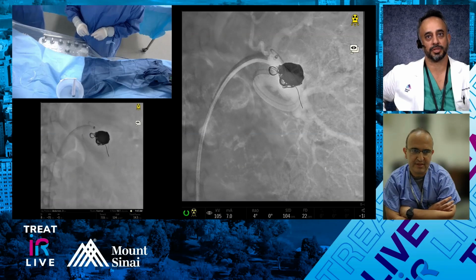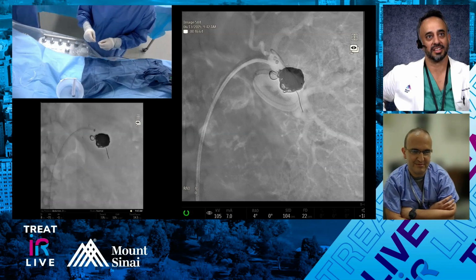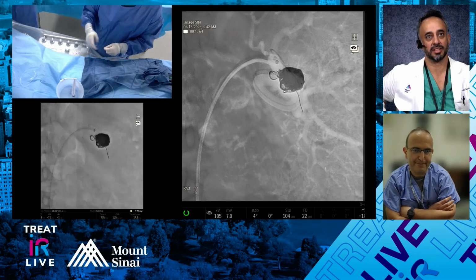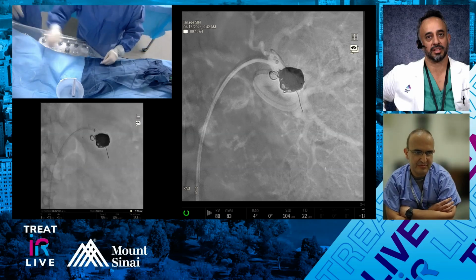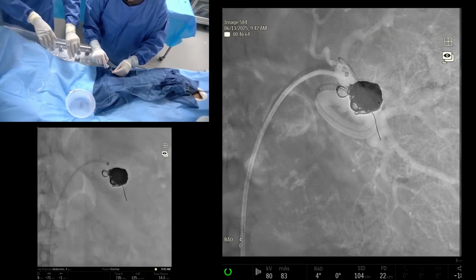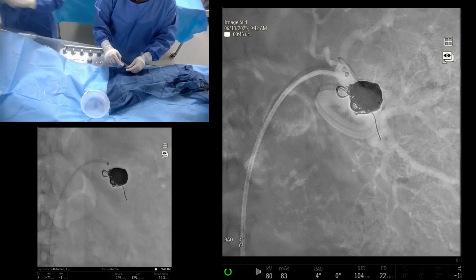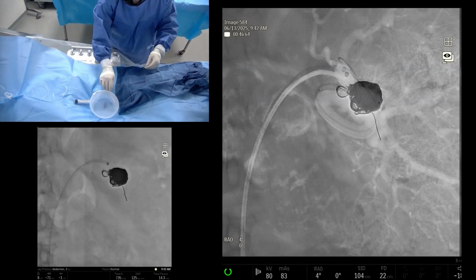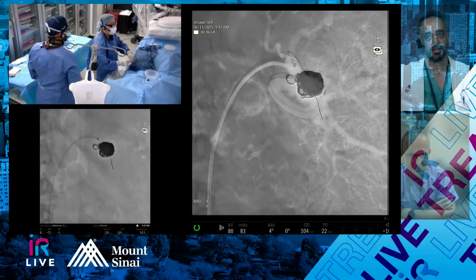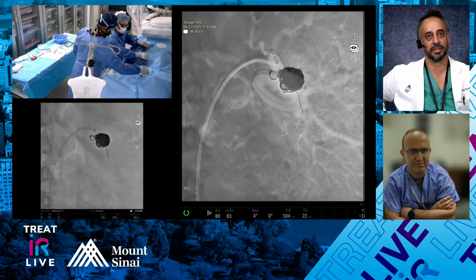It looks like that packing coil just sort of leaked into your aneurysm. And it's just filling up quite nicely, creating a nice dense pack. So what we're gonna do is we'll do an angio after this. We're gonna set up to do an angio after. And maybe I'm just imagining this, but it seems like the coil pack is increasing in density, which is a good sign when it starts clotting, right? Yeah, agree. Absolutely.